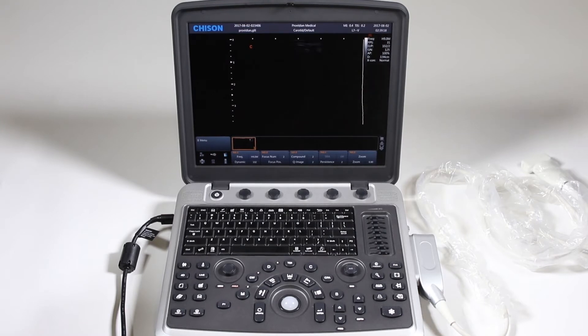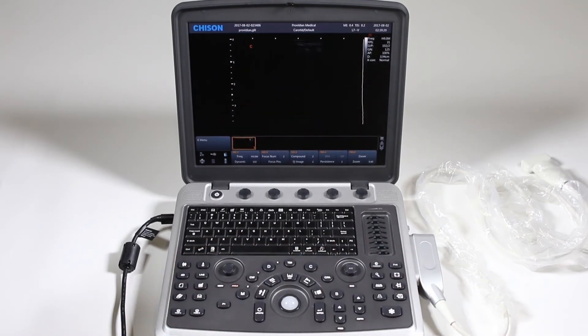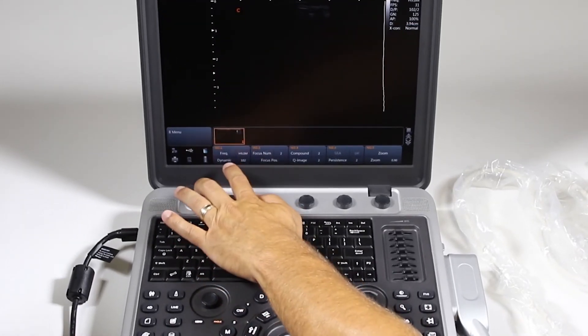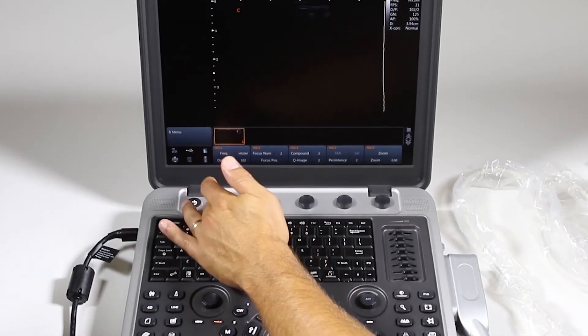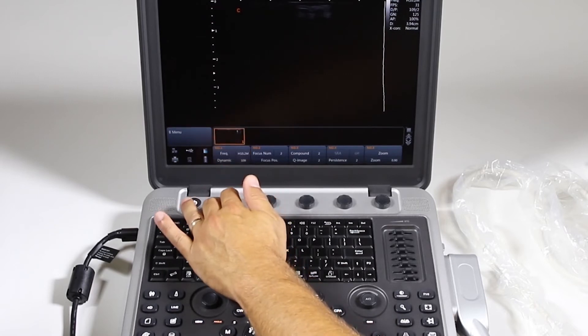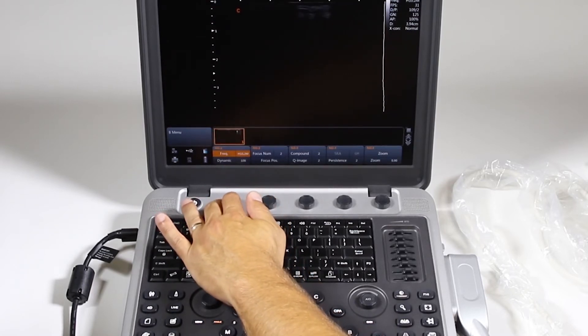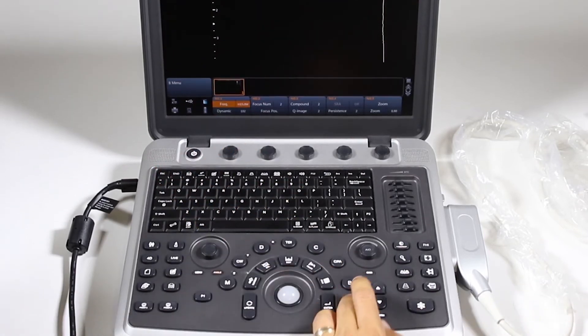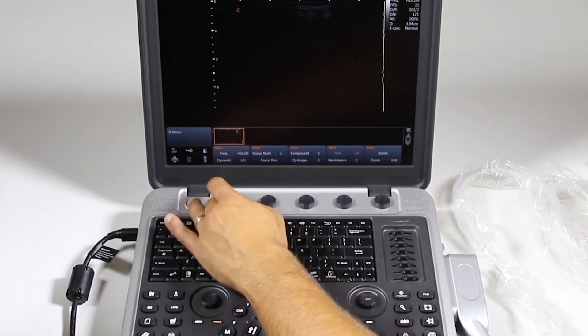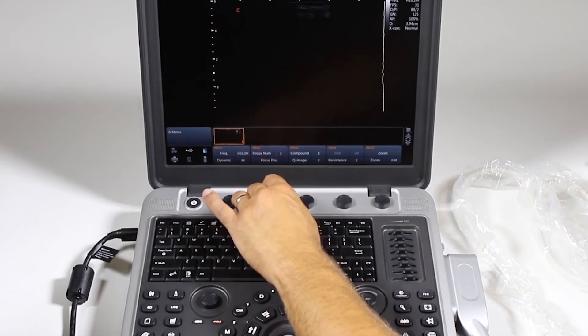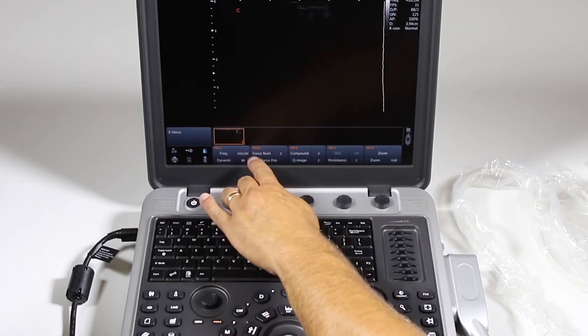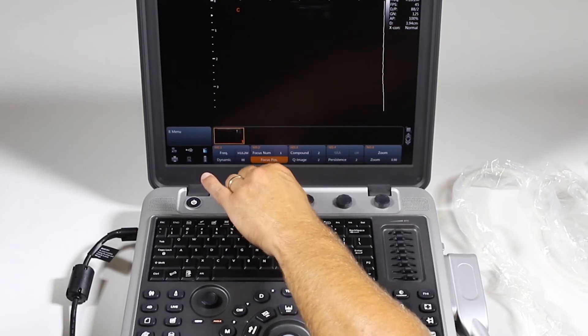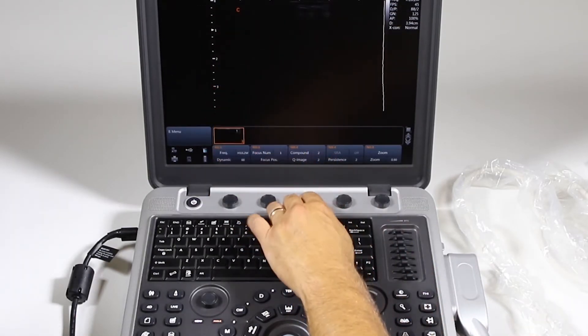Now in the first video, we discussed all of these keys and what they do. So in standard B mode, we have our frequency here, which can be adjusted by pressing down here. And it'll change the frequency of the probe. You can also change the frequency down here as shown in the earlier video. You have your dynamic range by twisting it. Focal number, press down. This top row, you're going to click down. Bottom row, you're going to twist. So see I'm changing the focal position.